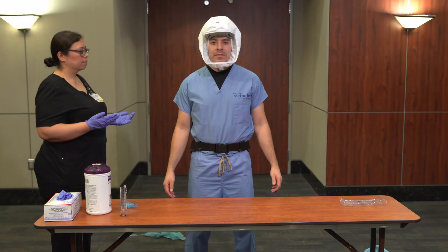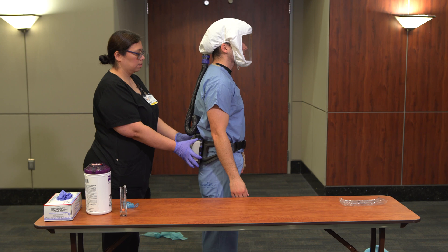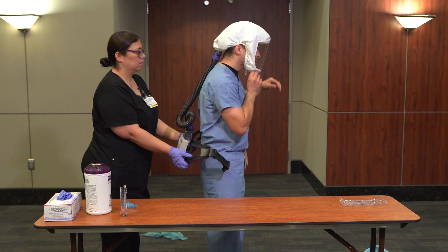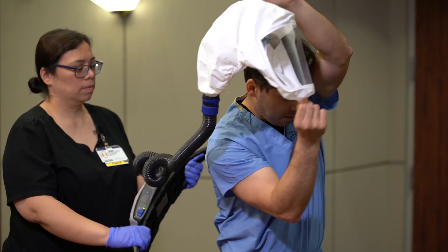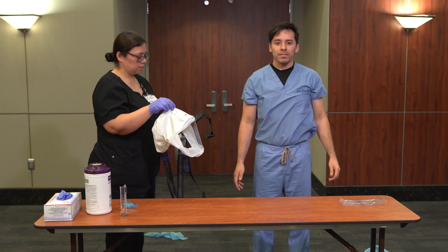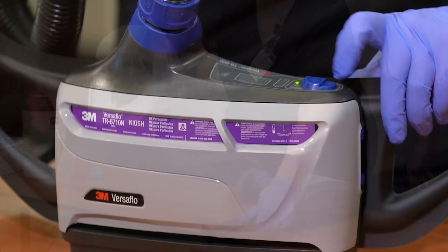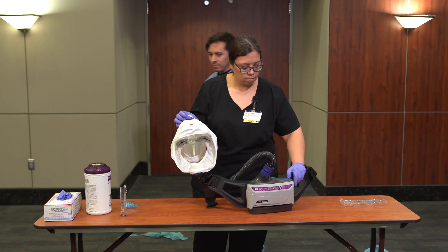To doff the PAPR, the buddy should perform hand hygiene and don gloves. Turn your back to the buddy and ask him or her to hold the blower assembly. Once the buddy has held onto the blower assembly, unbuckle the belt. Lean slightly forward and remove the head cover by pulling the loops at the top of the device and under the chin, lifting up and away from the head, and hand the head cover to the buddy. While holding the blower assembly, the buddy should grab the head cover from the caregiver — the device should remain on during this process. The buddy should then place the device on a clean surface and turn off the unit. The healthcare worker should wash their hands and exit the area.